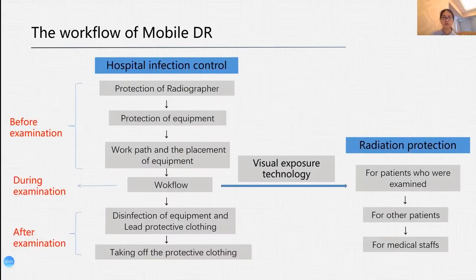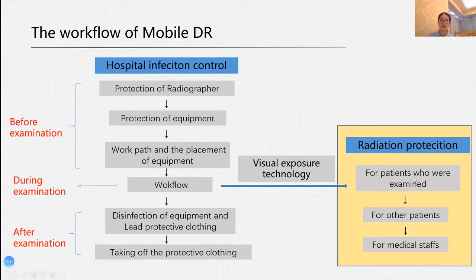As we know, the COVID-19 patients would receive chest radiography almost every 2 days or every day. So, in order to reduce the radiation dose, radiation protection is very important, not only for patients who were examined, but for other patients and for medical staff.